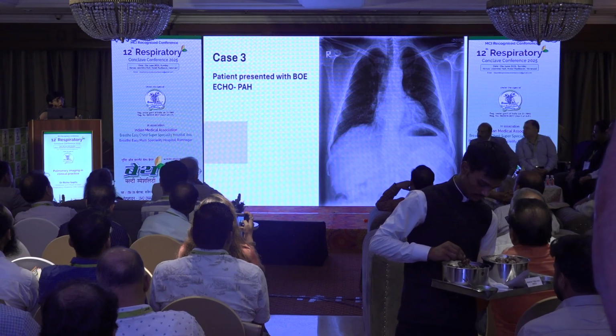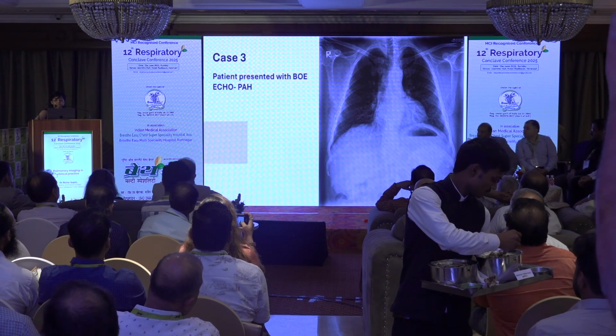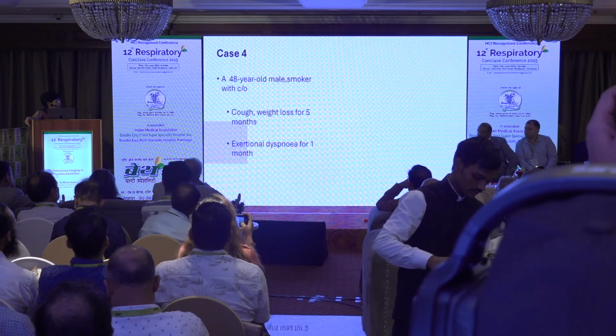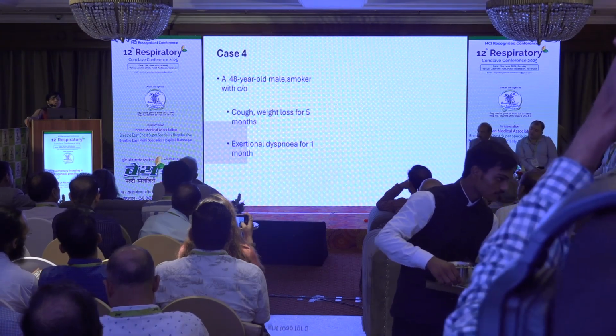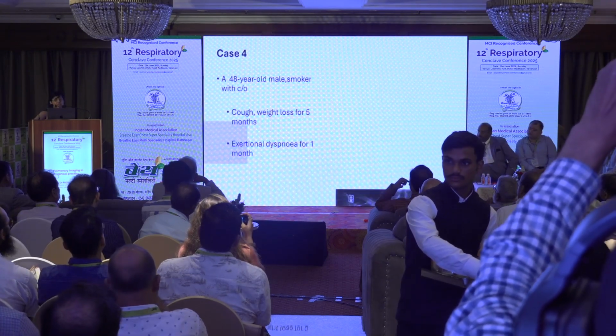So sometimes X-rays are very, very good into the inside of the patient, but you have to be a detective. Let me take you to another case. A 48-year-old male smoker who presented to us with history of cough, weight loss for 5 months, and some exertional dyspnea of 1 month. This was a chest X-ray.